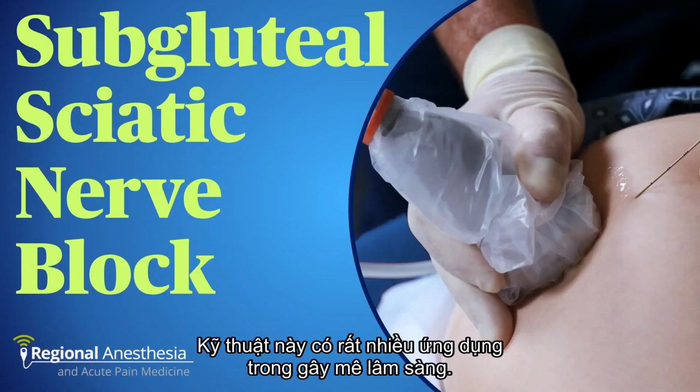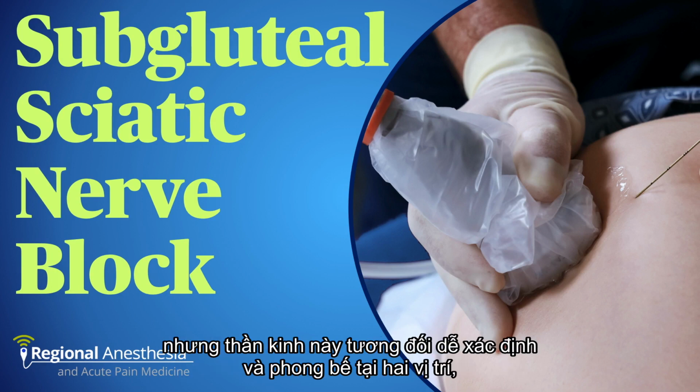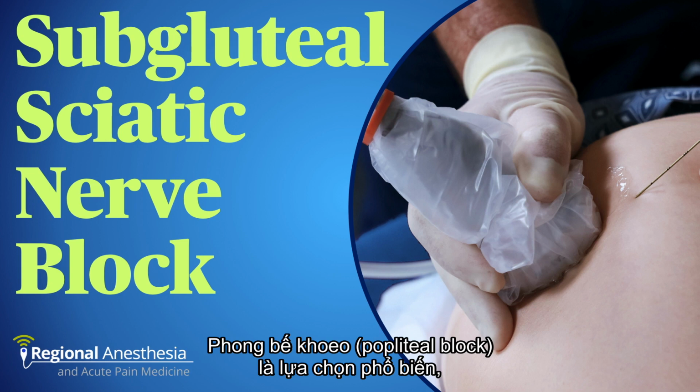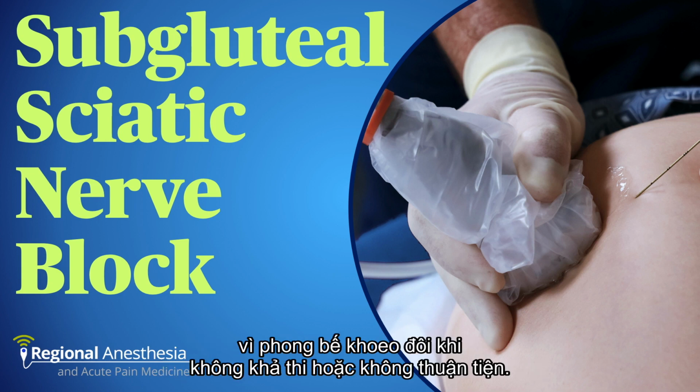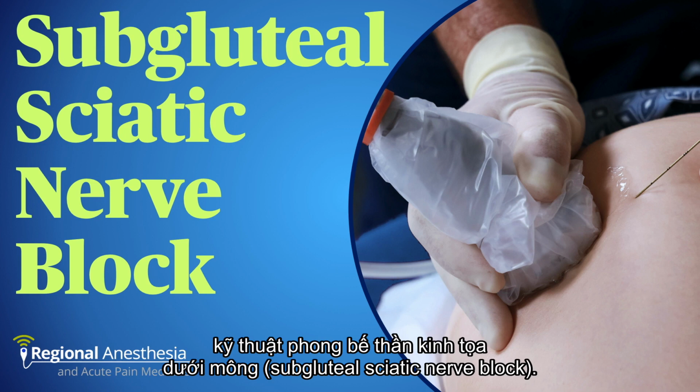The sciatic nerve block is an immensely valuable technique that has many applications in clinical anesthesia. While the sciatic nerve can be blocked at a number of locations along its course, the nerve is quite easy to find and block in two specific locations, the popliteal fossa and the subgluteal region. The popliteal block is a favorite, but it's also good to know how to block the subgluteal sciatic, as the popliteal may not always be available or convenient. In this video, we'll discuss the anatomy and technique for the subgluteal sciatic nerve block.